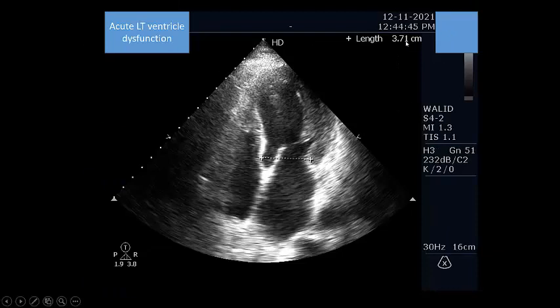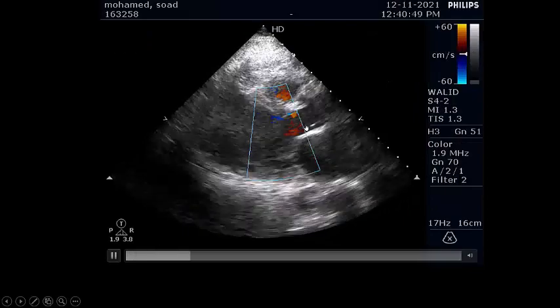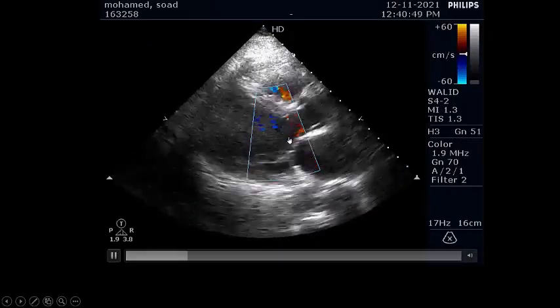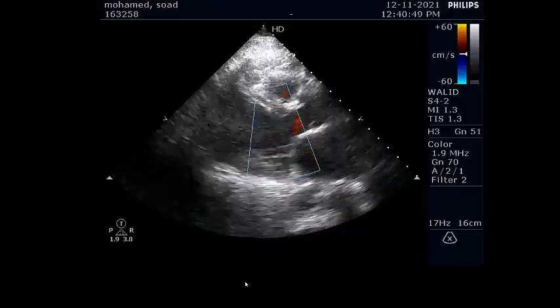The end diastolic diameter is 3.7, it's normal. The heart is not dilated. That means it is an acute process, not a chronic process with remodeling. If it is an acute process, the ejection fraction is not too bad, and the state is very bad as regards shock, pulmonary edema and hypoxia, you should think about the other important factor causing this, which is the valves, aortic and mitral. You should search for acute valve lesions, as we mentioned in the previous cases. And you see here, no regurgitation in the aorta and no regurgitation in the mitral. So no significant regurgitant lesion and no bad ejection fraction.